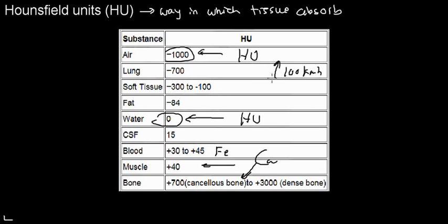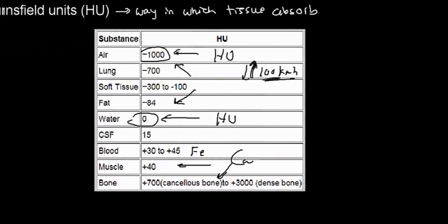That doesn't mean that you can't go, well, I'm not talking about legally, that doesn't mean that you can't go faster or slower. That just means that this is a set speed that is, so to speak, safe. So we can say this is a set standard that can be compared to other indexes here, to say, oh, it absorbs more than water, less than water, more than air, less than air. That is really what you need to know as far as the Hounsfield units.